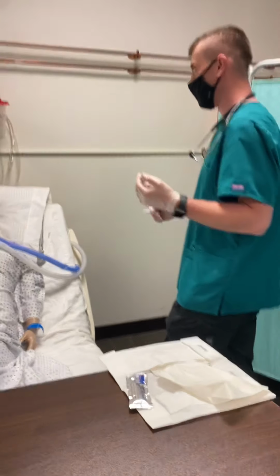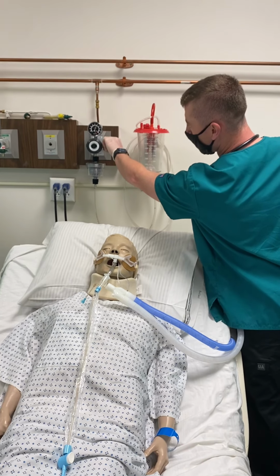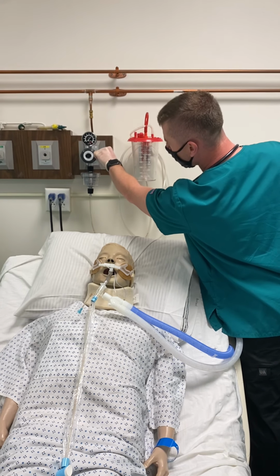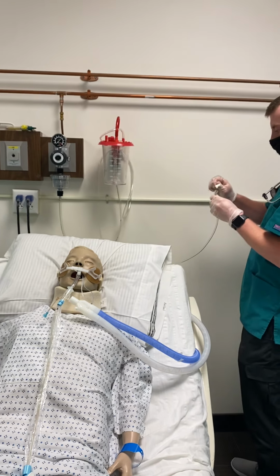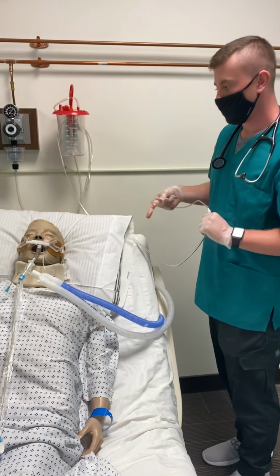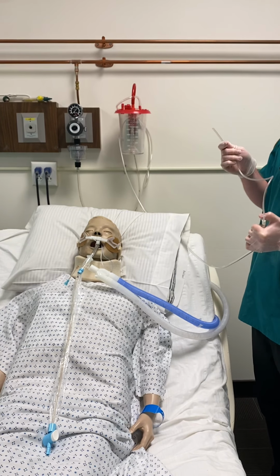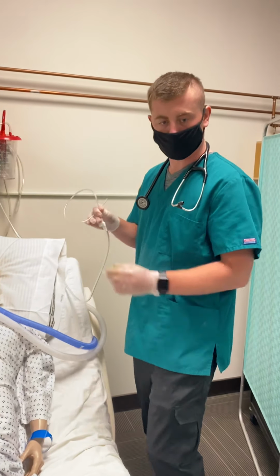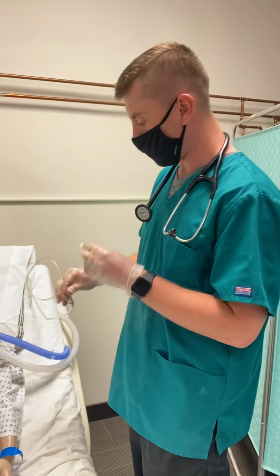Then I would turn on the suction between 120 and 150 millimeters of mercury. Following that, I would lubricate the suction catheter with this lubricant.